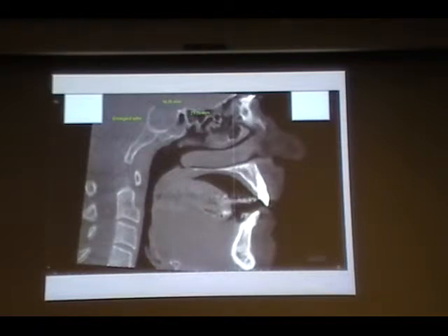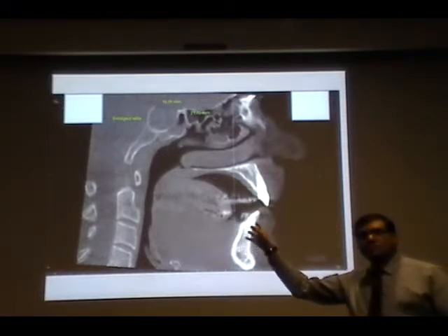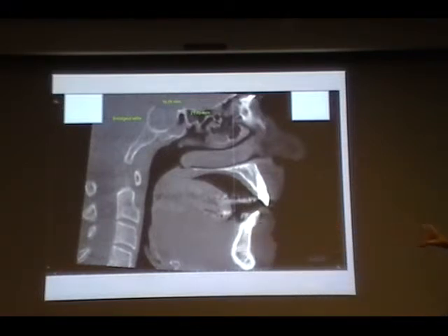Somebody said to me that they were not able to see the maxillary sinuses, right? So here in this view, you can see clearly the sinuses or part of them. So again, remember, depending on the slice, you could miss some structures, or some structures are visible only in a few slices.